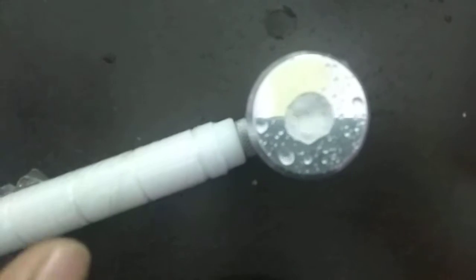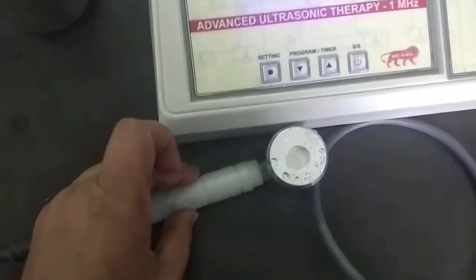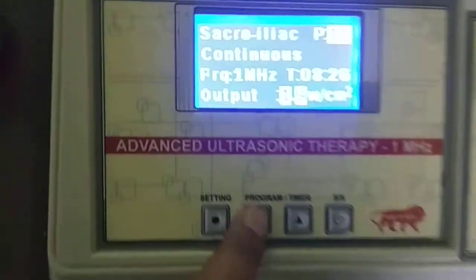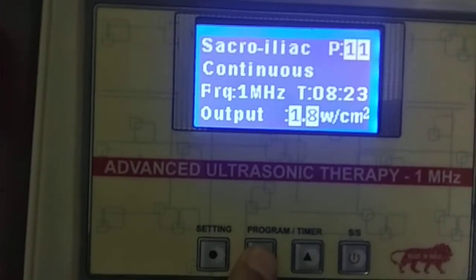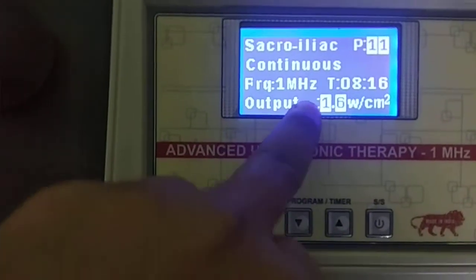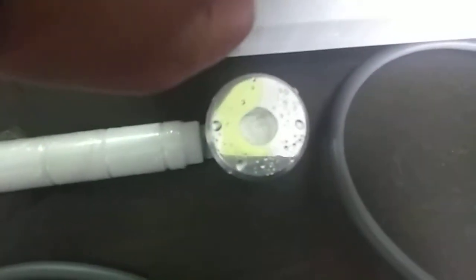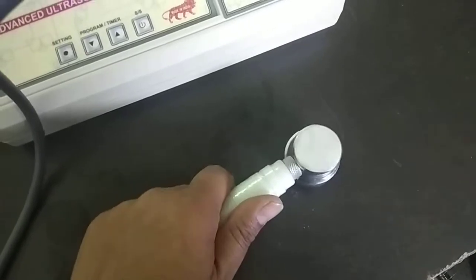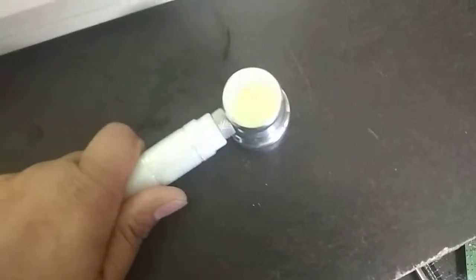You can see the device is giving output. If you want to increase or decrease output, press this button for decreasing — you can see it going 1.8, 1.7, 1.6. If you decrease output, the intensity will also decrease. You place the handle where you want. You can keep it in one place, but not for maximum time, or you can drag it like this.